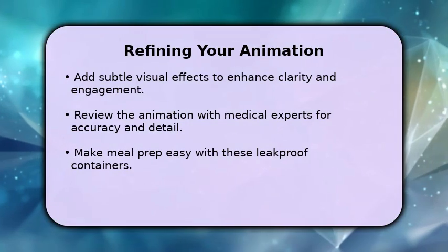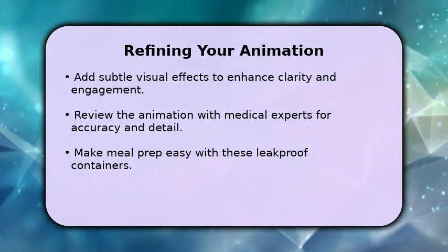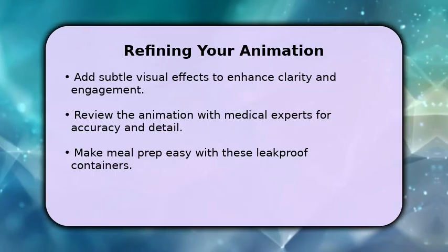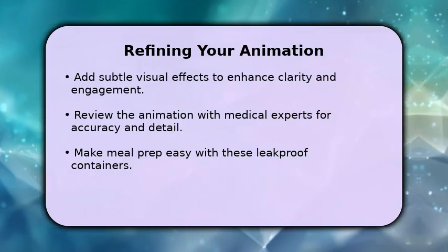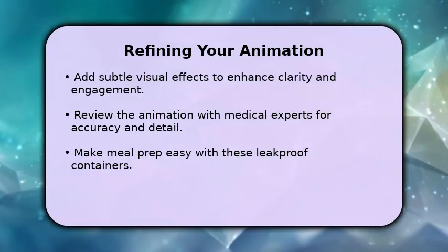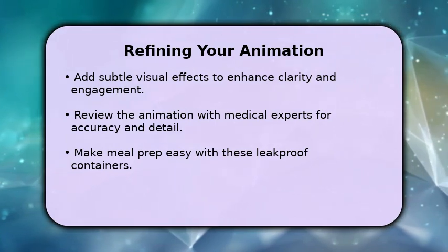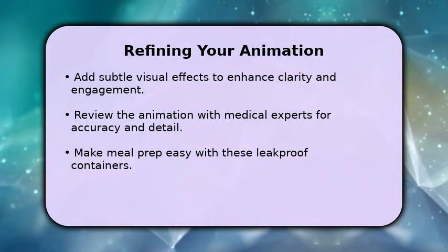After completing the core animation, refine it with subtle visual cues. Consider adding a soft glow around the copper to emphasize its active role. Review the entire sequence with medical professionals to ensure anatomical and procedural accuracy. Pay close attention to timing and pacing, making sure the information is digestible.